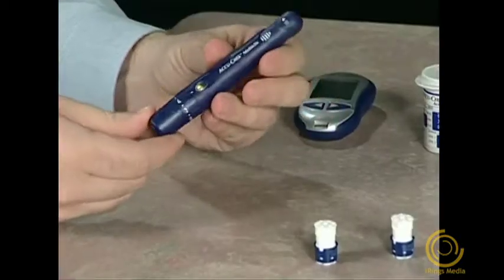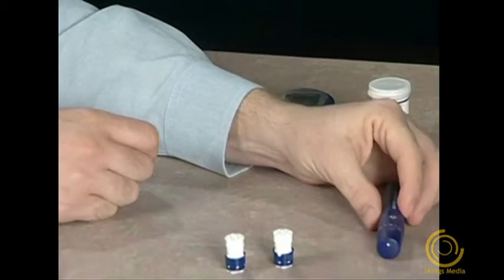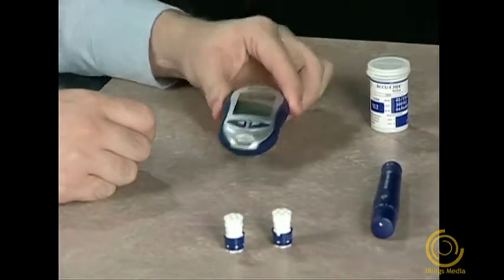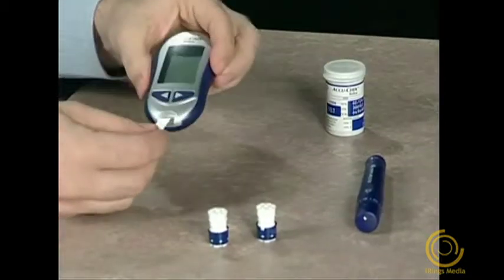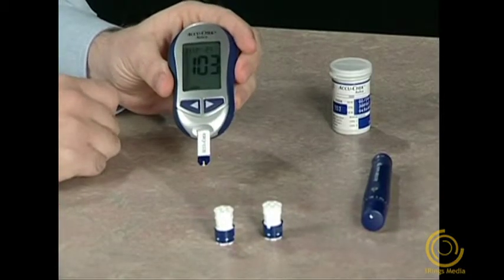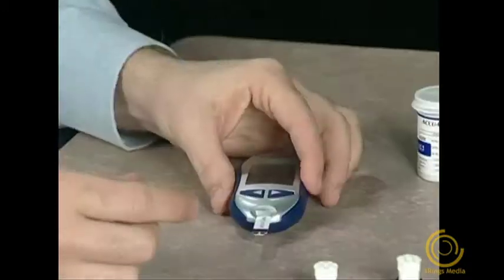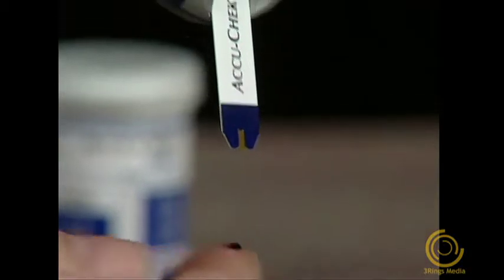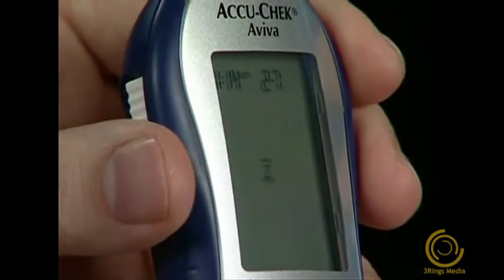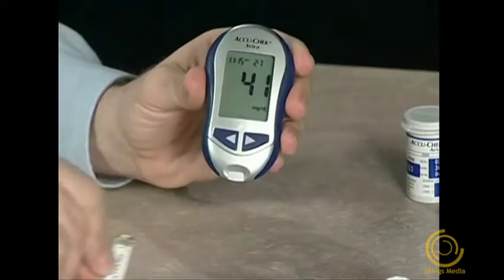To obtain a blood sample, put the lancet device against the side of the finger and press the yellow release button. Now let's simulate a blood glucose test using our control solution. Put a test strip into the meter in the direction of the arrow. The meter turns on. When the strip and the flashing blood drop appear, touch the substitute blood sample to the tip of the yellow end of the test strip. When you see the hourglass symbol flash, you have enough of your substitute blood sample. The result will appear on the display within five seconds. Then remove the used test strip.